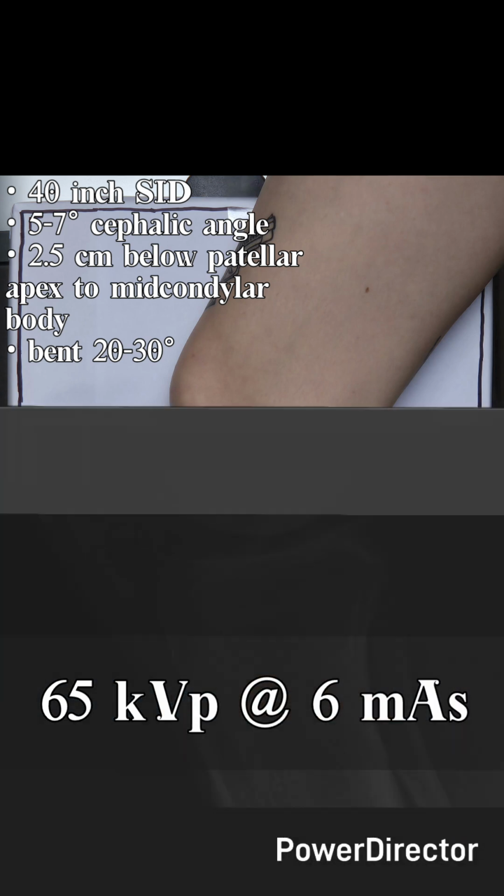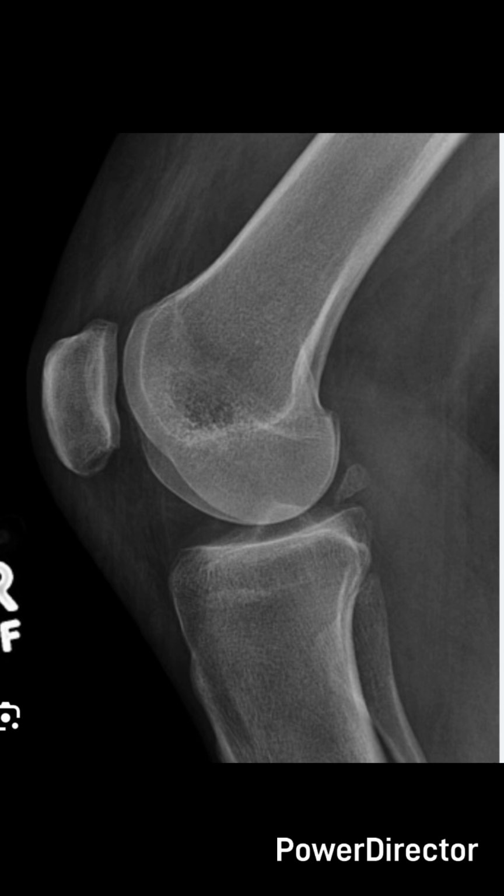And here's the x-ray, ta-da! Look at those superimposed condyles, very nice. That's pretty much all you want from a lateral knee.